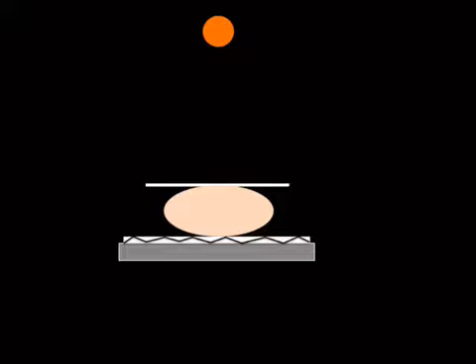From that perspective, the breast doesn't move. Remember, you have to have this prolonged, because your MA is lower, you have to have a little bit longer exposure. So that creates potential for motion artifact, but if you smash the breast down, they can't move anymore. A smashed breast is actually closer to the bucky, which is going to create less geometric magnification. And with less motion and less geometric magnification, you've got improved spatial resolution.